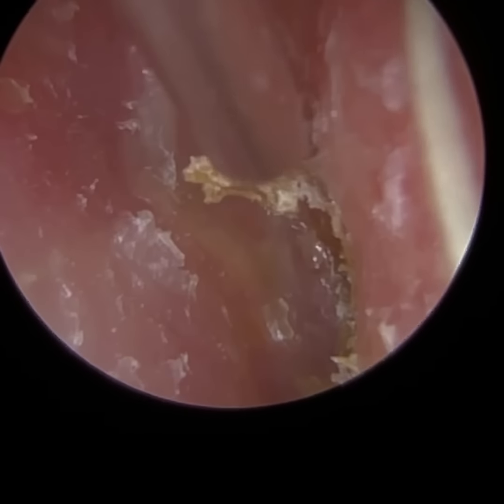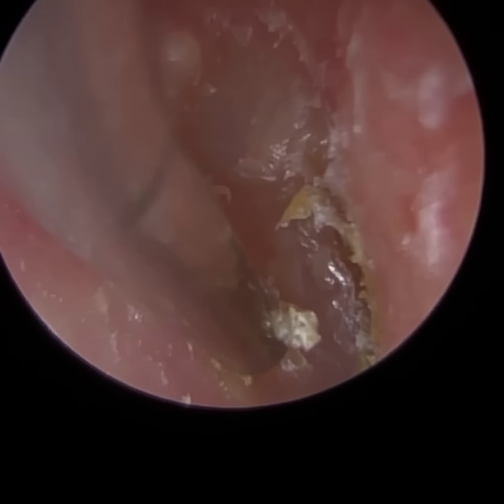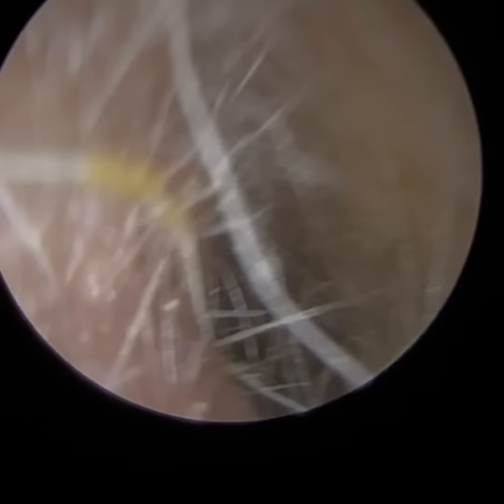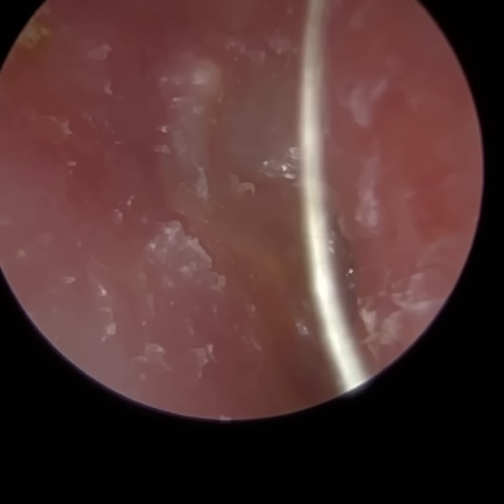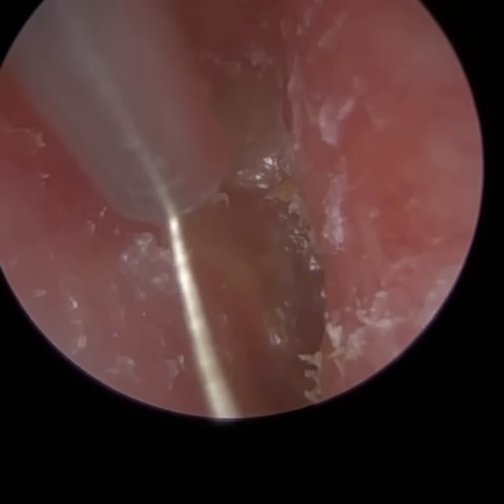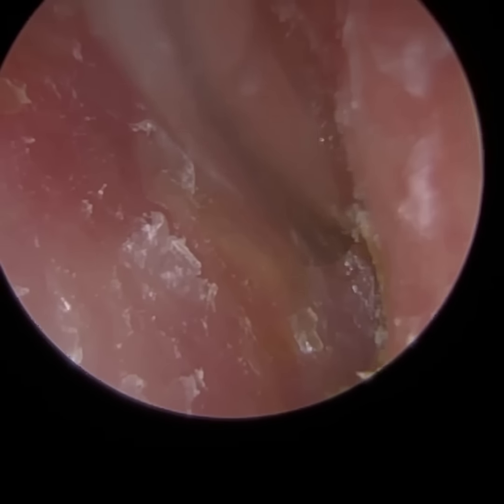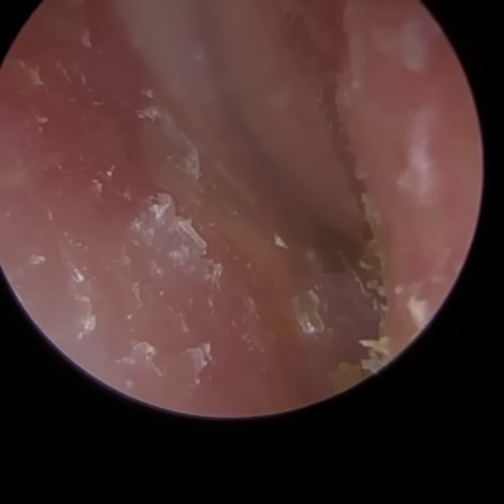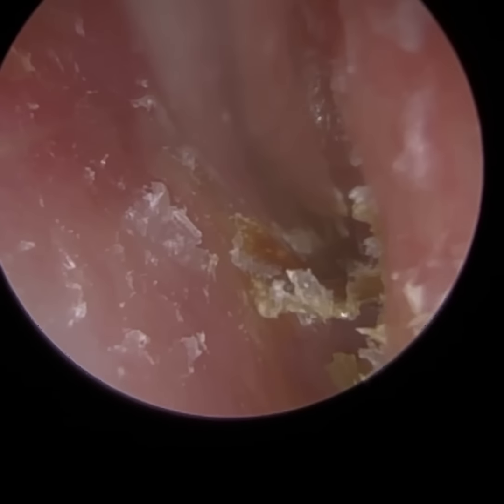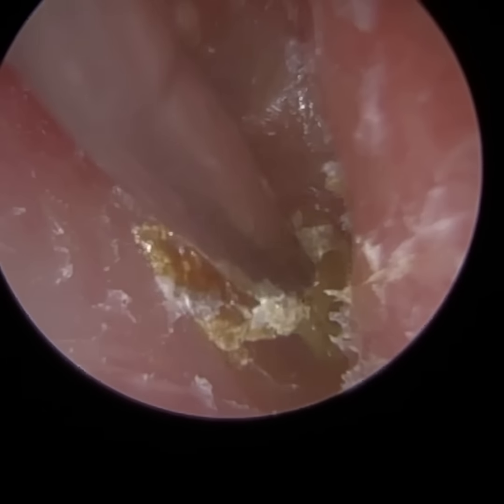I'm just busy trying to peel off skin. So essentially, near the eardrum, this patient's ear canal is narrowed, and it could just be as the skin's migrating off the eardrum, it's collecting in this narrowing, and it's unable to fully migrate because of the curvature, the bends, the narrowness of it. And that's one potential reason I feel the skin's failing to migrate. So again, there's no wax, it's pure dead skin, keratin. And you can see we're here, just here now, we're peeling the skin. It was almost hidden in the anterior recess, and it just wasn't able to escape. So it's very likely the cause of all this skin.